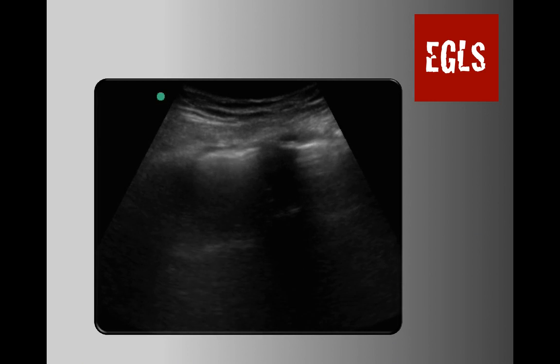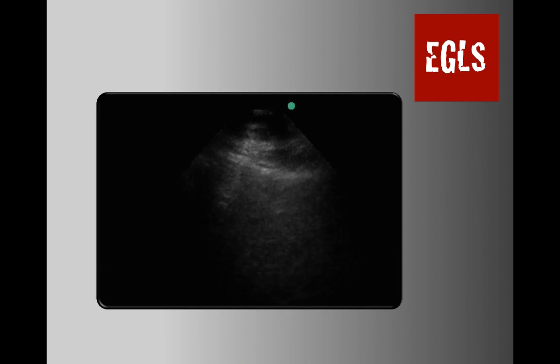Again, right there, so you see the pleura behind the ribs. There's that small shimmering, ants walking on the line. Yeah, and there doesn't have to be a lot of movement for us to be able to see it when we know what to look for. Here's another example here that's done with a phased array probe. If you have difficulty assessing for lung sliding, to make your life easier, you should decrease the gain.